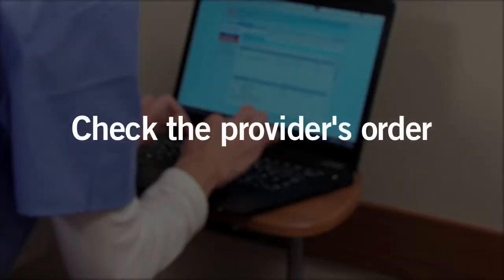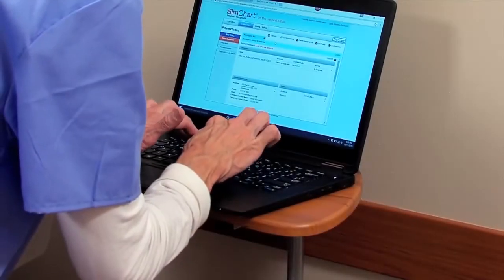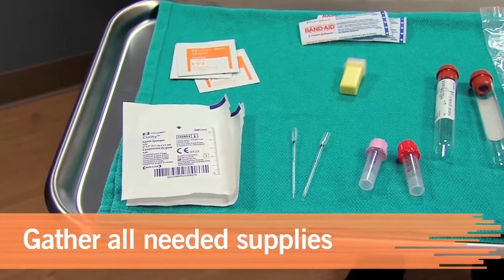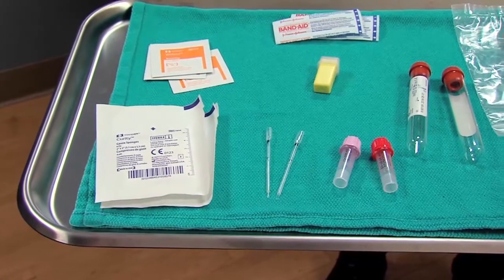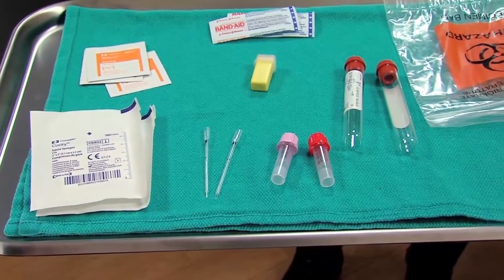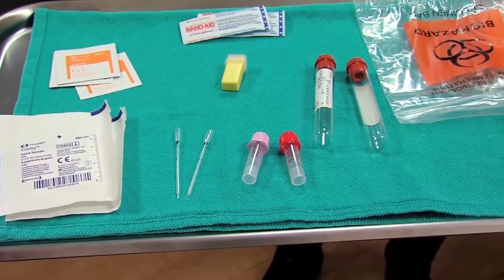Check the provider's order and the requisition form to determine which tests have been ordered. Gather the appropriate tubes and supplies before you begin. Once the skin has been punctured, you must proceed quickly so that the blood doesn't clot before the entire specimen has been collected.